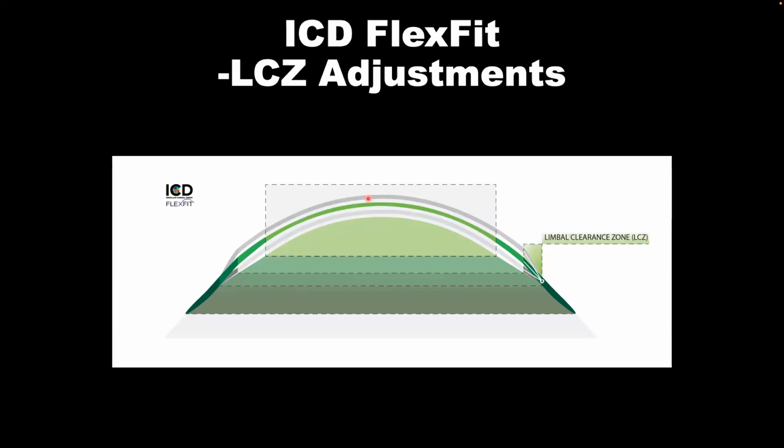So going back, let's say you did +5 and you had 300 microns here and you are okay with that. If you do a +5, these 300 microns will go up 125 microns, right? So then you will have 425 microns.